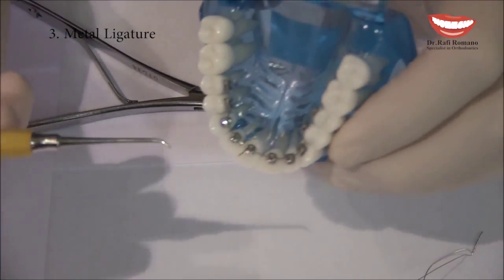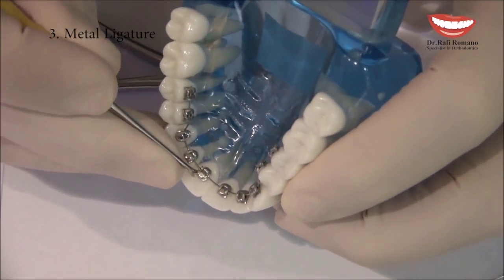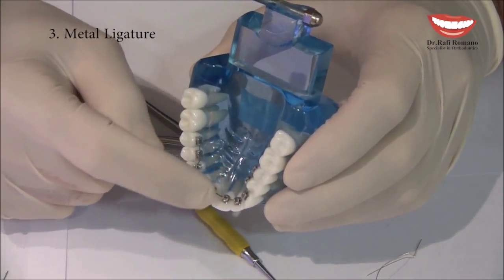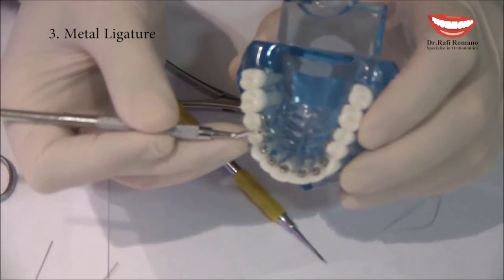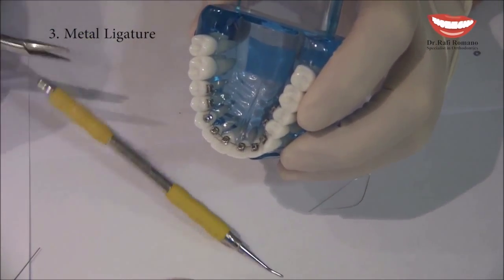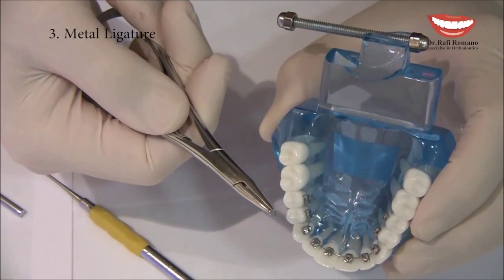I take the ligature director and bend the wire end under the wire. I usually take my hand to feel that there are no poking wires, because the tongue is very sensitive. When you want to reopen it, I take the explorer, take out the extra wire I left, take the mosquito, change the angle, and take it out.